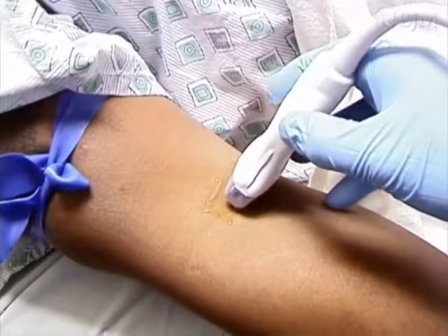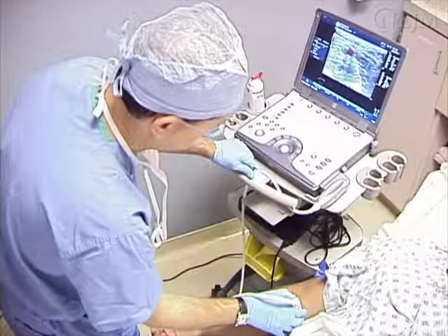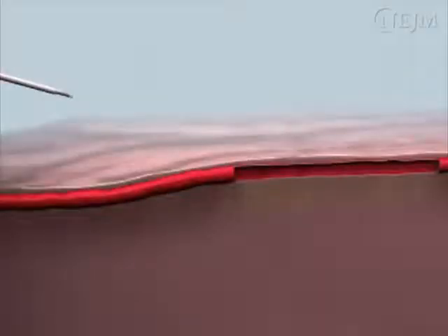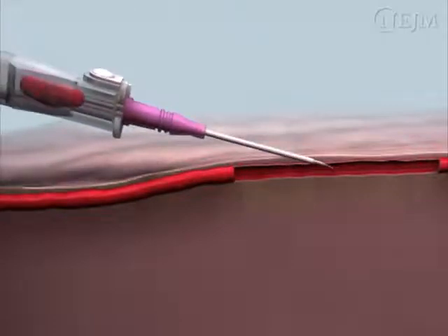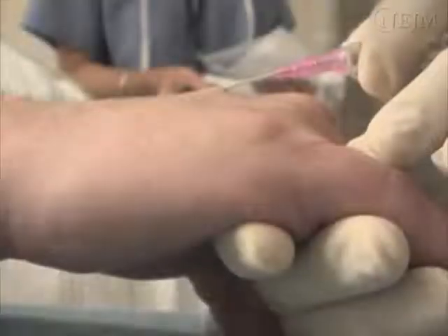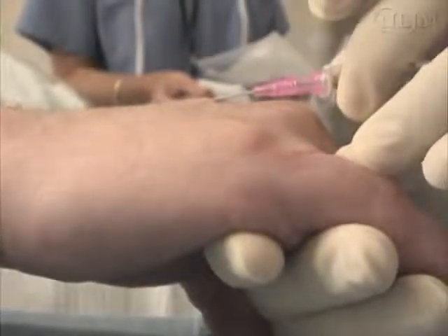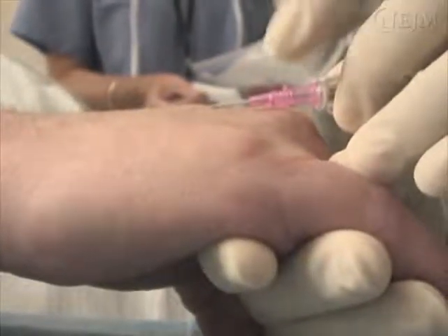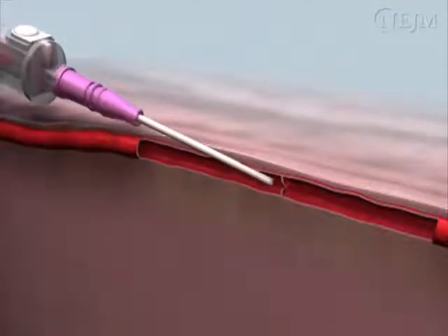Transillumination or ultrasound may also be used to help locate a vein. These have been shown to improve the success rate of the procedure and to reduce the amount of time needed to perform it. Blood might flash back into the chamber if the tip of the needle has entered the lumen, but the cannula has not yet entered the vessel lumen itself. This problem can be avoided by reducing the angle of the catheter and advancing the needle a few more millimeters into the vein.